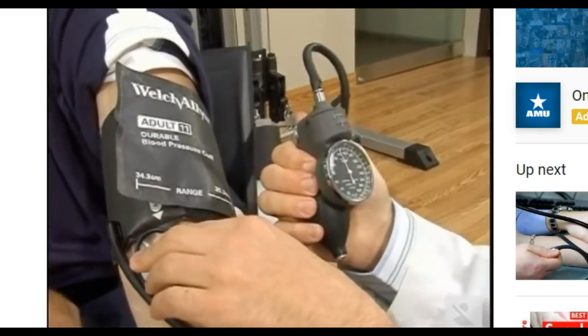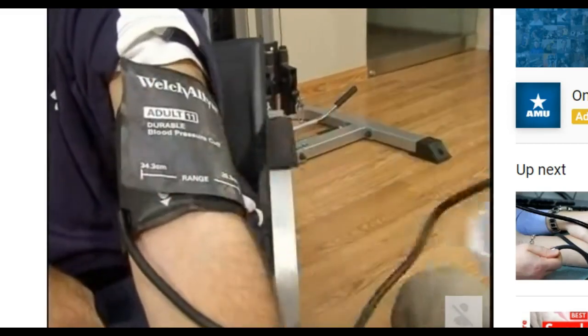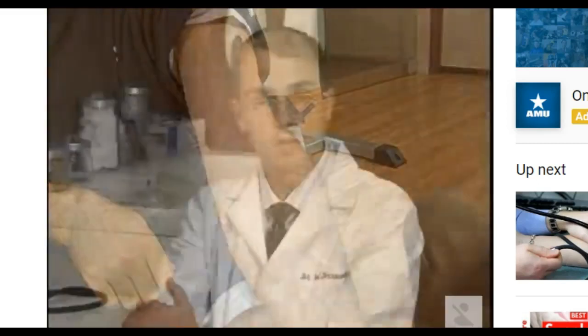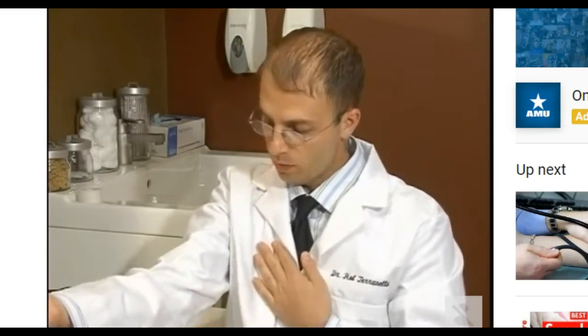Another important tip is your posture. You should be seated up straight. That's not as important. The main thing is your elbow should be relaxed. So when you take your blood pressure, you want to have it relaxed on a table or something. And you also want the elbow or the brachial artery at around the same level as your heart. So for me, it would be about this high.